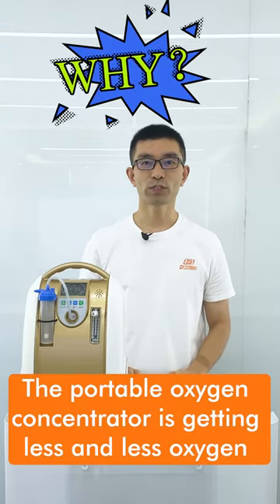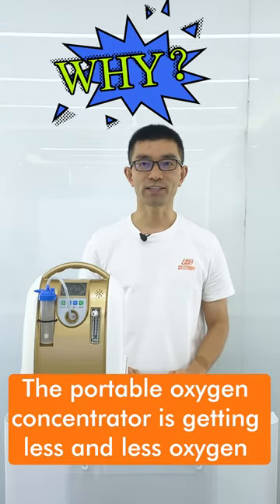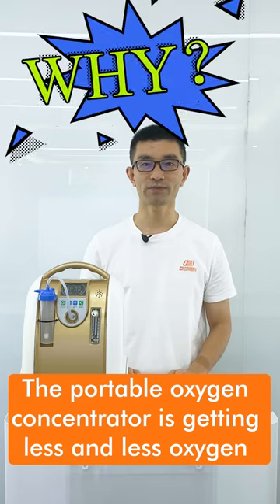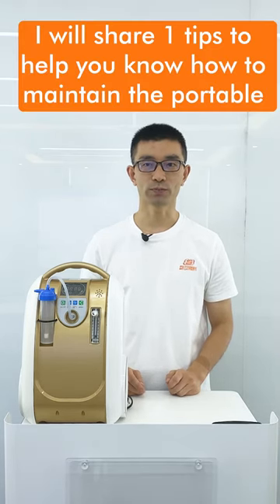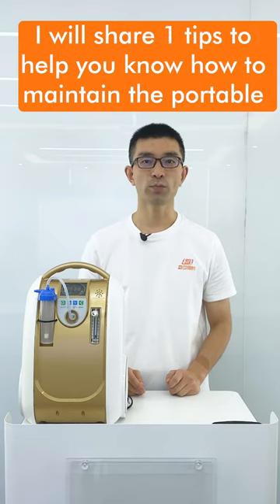Are you wondering why the portable oxygen concentrator is getting less and less oxygen? In fact, it is because of a problem with the maintenance of the filter. Today, I will share one step to help you know how to maintain the portable oxygen concentrator.